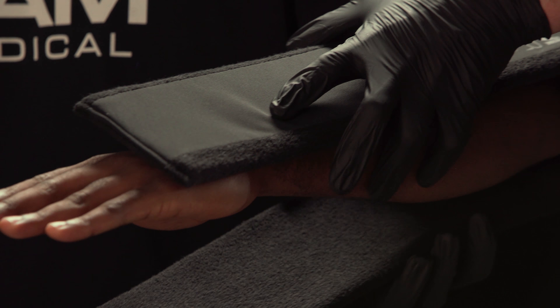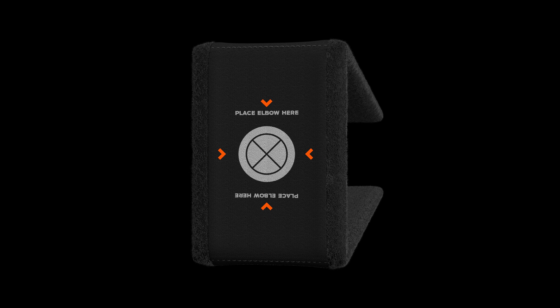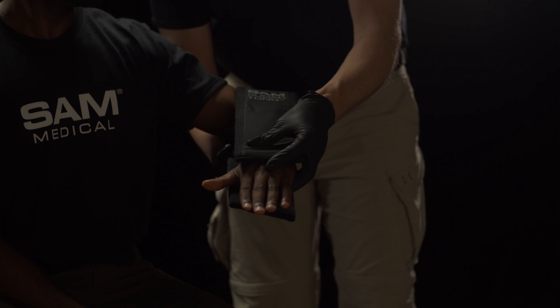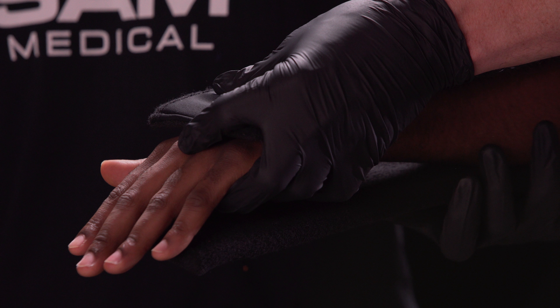Place the patient's uninjured arm snugly in the pocket of the Sam Sugar Tong Splint, aligning it with the printed X on the exterior to allow for proper measurements. The dorsal end of the Sam Sugar Tong Splint should be located just past the end of the knuckles. The palmar side should end at the mid palmar region.